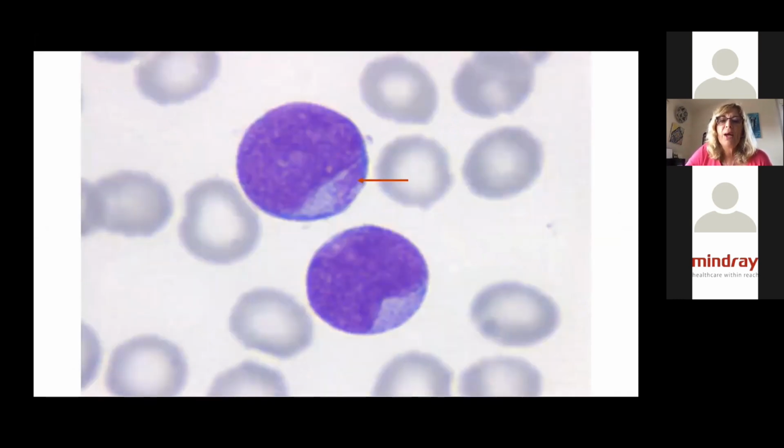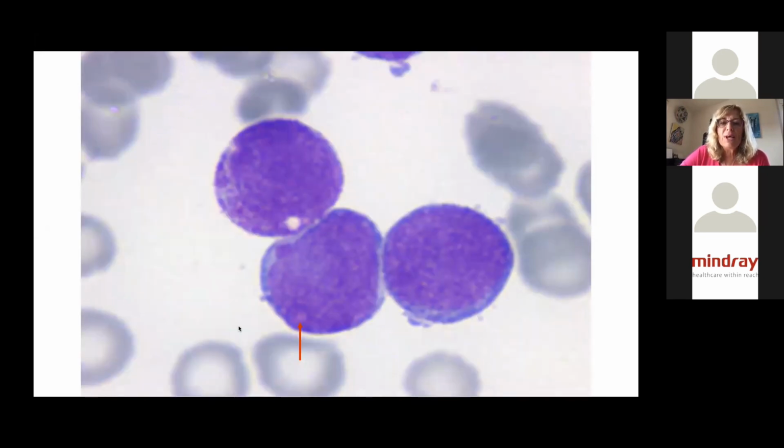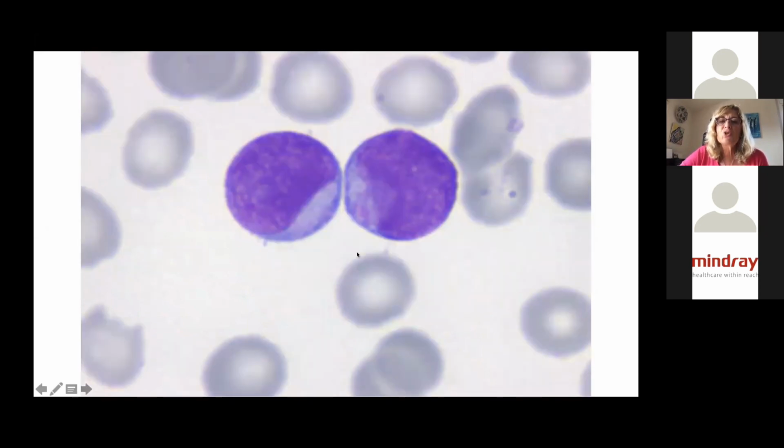The peripheral blood smear showed again blast cells. Some of them were granulated. Some of them showed the rectangular shape that I described before for the myeloid blasts. And also, in this case, it looks like there is a cup-like morphology in this nucleus. We can see granulation, nucleolus. Most of them are small in size, but showing granulation.